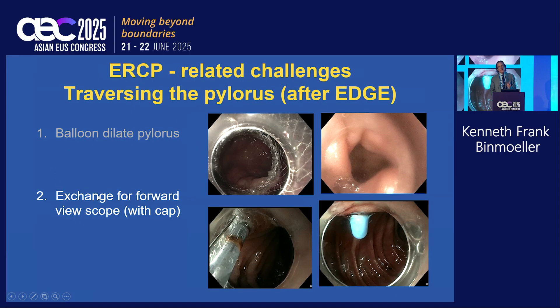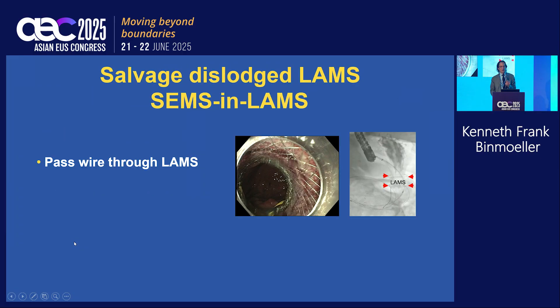The other option is to exchange the duodenoscope for a forward-viewing scope, but you must add a cap. Here you can see insertion of the forward-viewing scope across the LAMS and crossing the pylorus. The cap is extremely helpful — I think essential — to be able to access the papilla and place a stent for drainage.